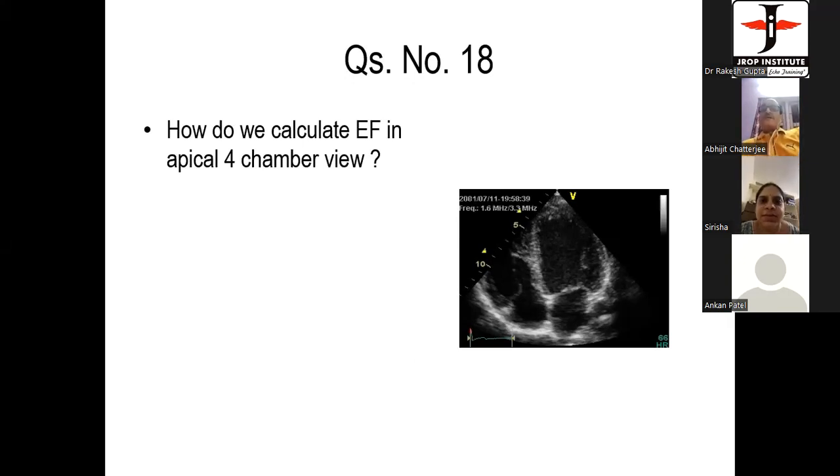And our machine will automatically give the EF, sir. Yeah, doctors are bad mathematicians. The machine will do all the rest for you. Yes, sir. Okay, thank you, doctor.